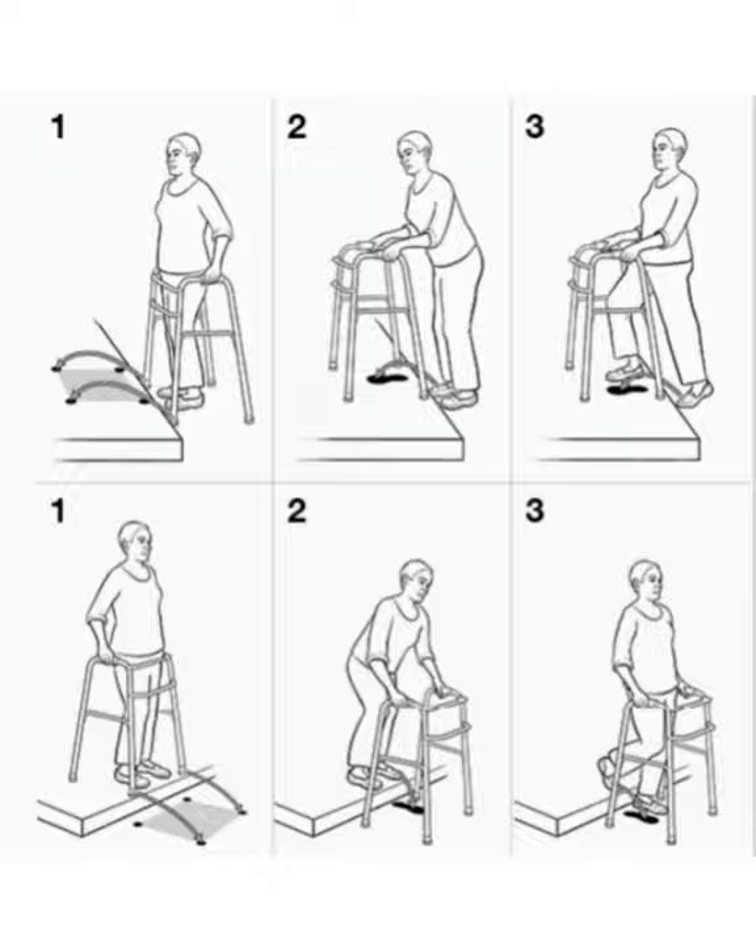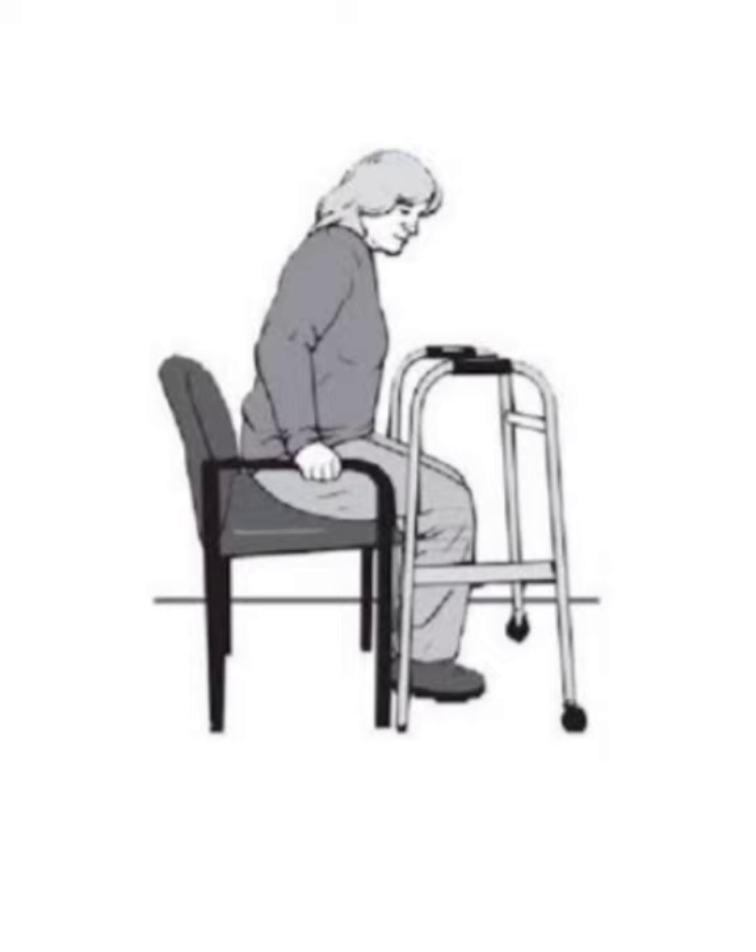A common mistake made when transferring with a walker is grabbing onto the walker at the wrong time, which can increase the chance for falls. When planning to sit, find a firm, safe surface. Back up to the seat until the backs of your knees are touching or close to touching the seat. Next, reach back for the seat with one hand at a time, then slowly lower yourself down.